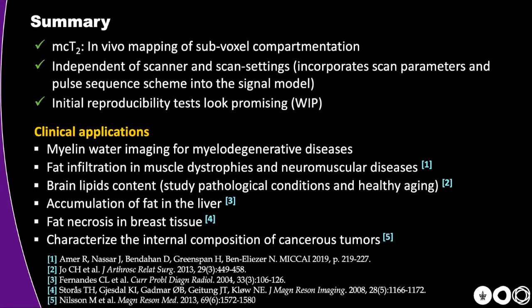It is independent of scanner and scan settings because the model itself follows the exact pulse sequence scheme and parameter values as they were used on the scanner. It's a bit tedious because you sometimes need to repeat it if you change your parameter set, but it gives you this huge advantage of being invariant to scanners.